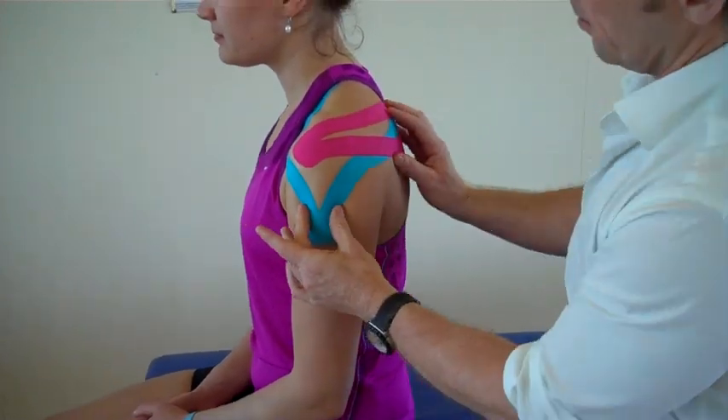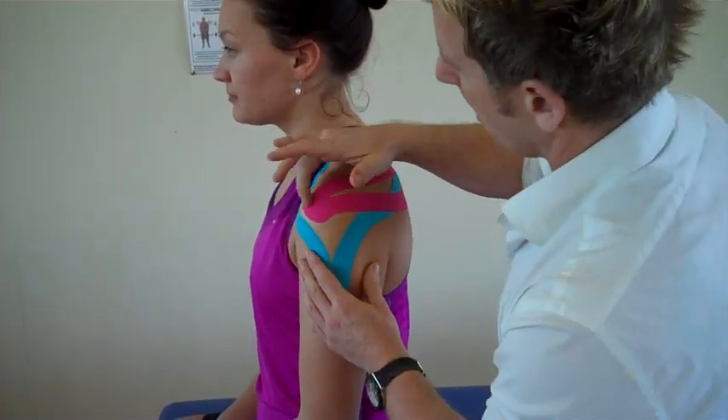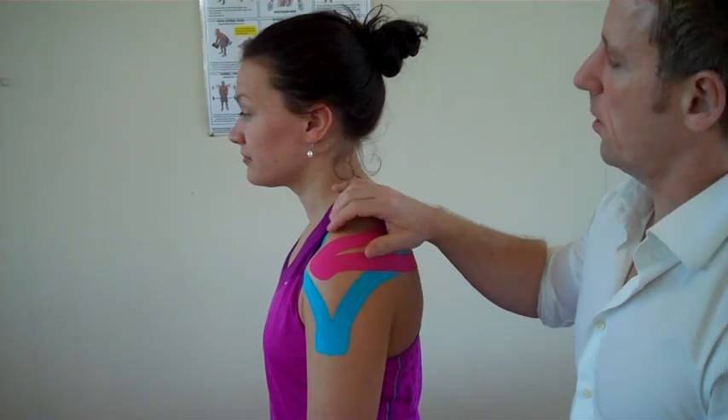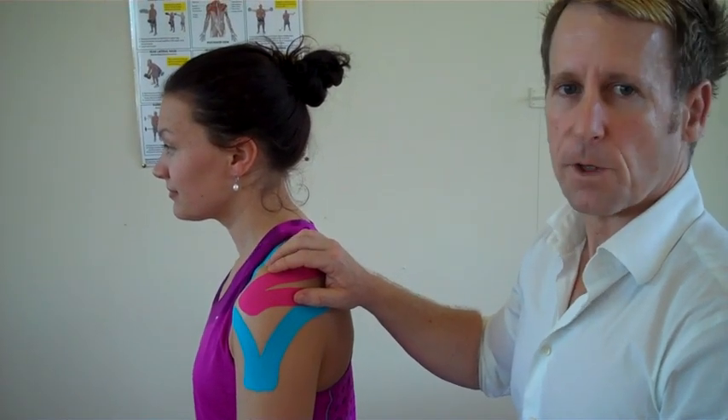So we've got a generalised piece of tape for the shoulder, and then we've got the second application that will stabilise the supraspinatus. If you want to learn about kinesiology taping, then look on John Gibbons' bodymaster.co.uk. Thank you.